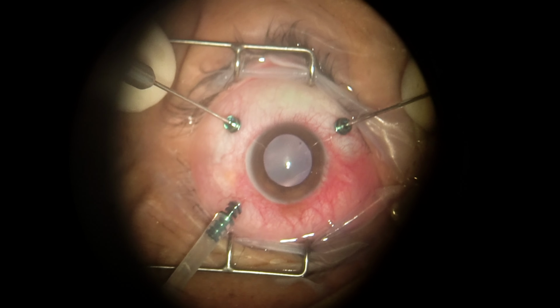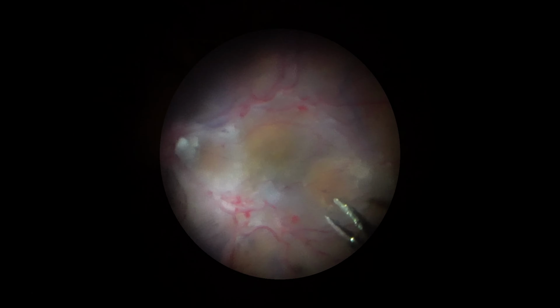Another brilliant blue staining is carried out, but now without an air-fluid exchange. It is possible to observe that another good staining is achieved, but the remains of the epiretinal tissues as well as astrocyte proliferations will be removed with a shaving technique, again cleaning all macular surface of any adherent tissues that could not have been removed in the first attempt of the peel after the first brilliant blue staining.